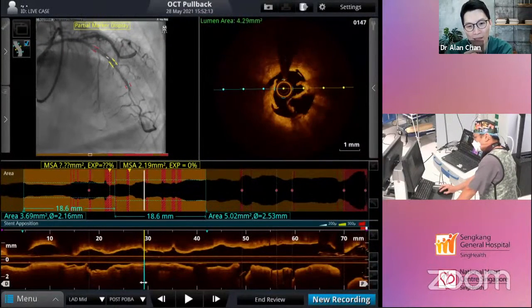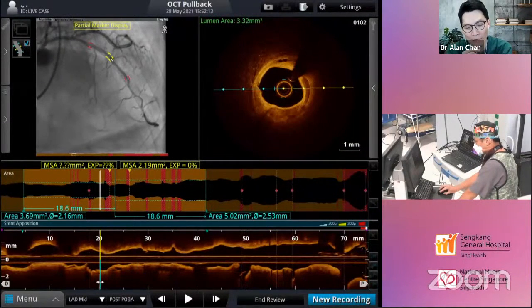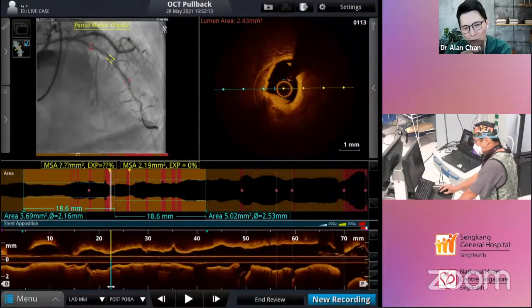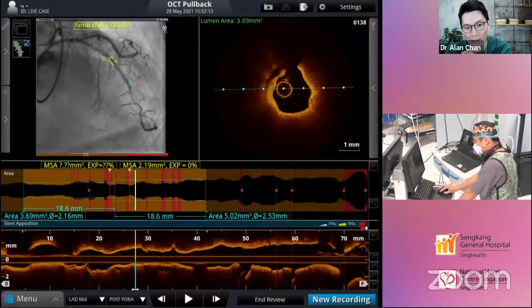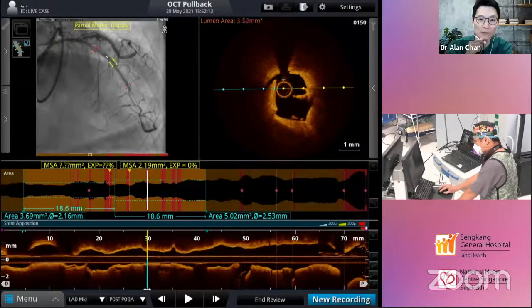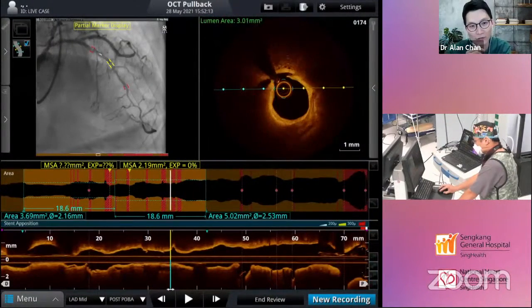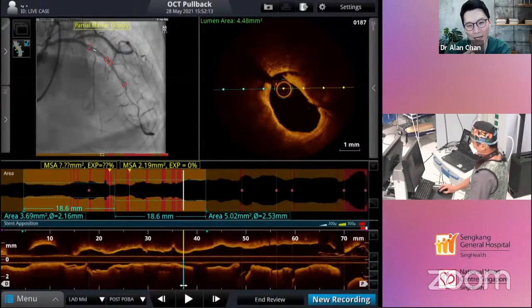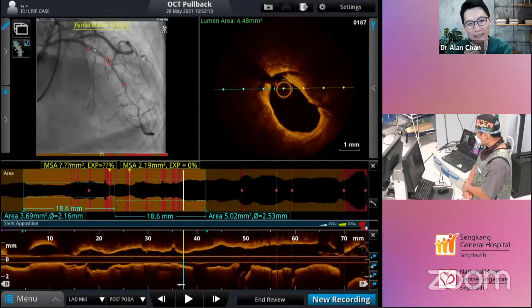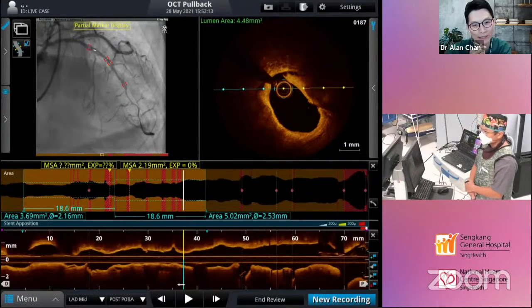But probably I think we don't really need atherectomy. Of course, it depends on the availability of the device. For example, if a 2.5 or 2.75 balloon still gives a waist in those calcified segments, probably you may use Shockwave to treat it. But of course, rotational or orbital atherectomy is out because of the nasty dissections. For rotational atherectomy, probably it may not have a great effect because the lumen has already expanded much. You cannot really abrade much, except if you put in a big burr, which is maybe too risky.